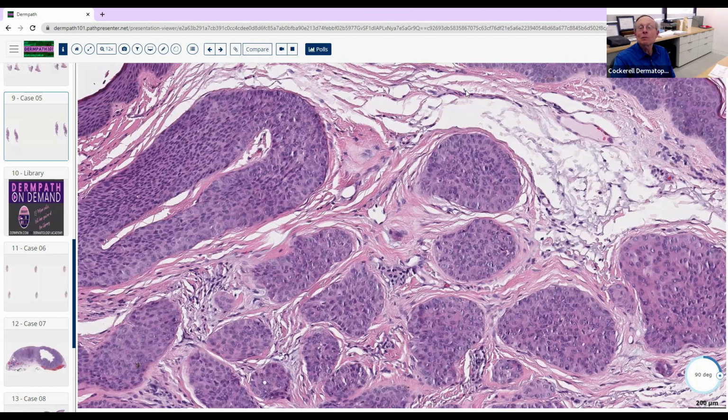That's a fibroblast. What shape is that? It's like a spindled shape. Yeah, they tend to be more spindly in shape. Don't have to be, but they tend to be. So if they're cuboidal, or they look like little squares, touching and hugging one another, or they're round and really closely opposed to one another, that tends to favor epithelial.